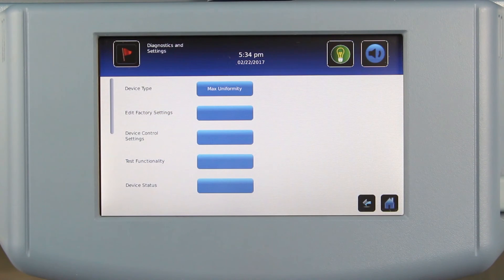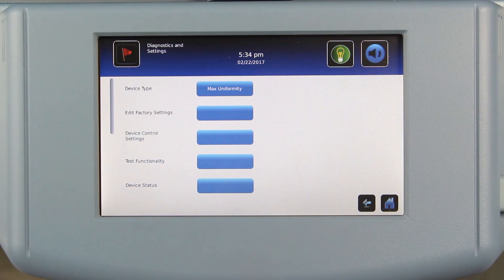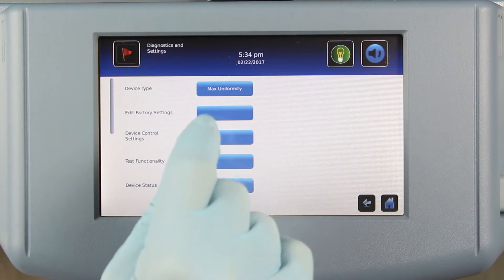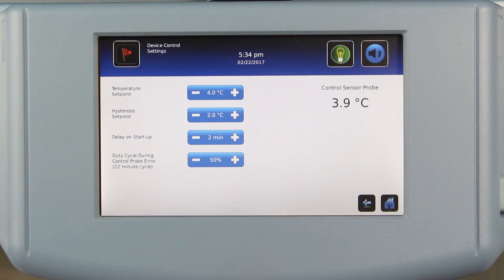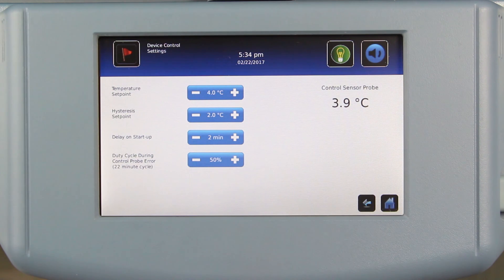We have also added a new security feature. To ensure that users don't unintentionally change certain settings, we added a technician-level password that restricts the ability to change the more sensitive and specialized settings.